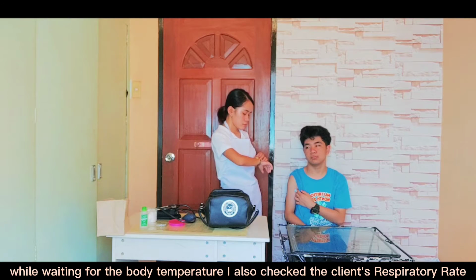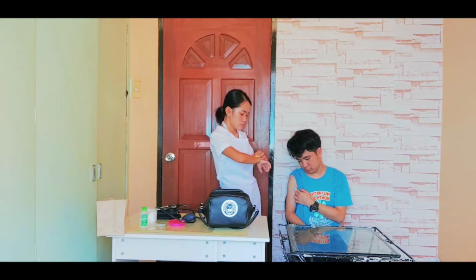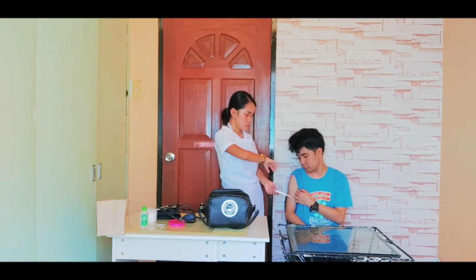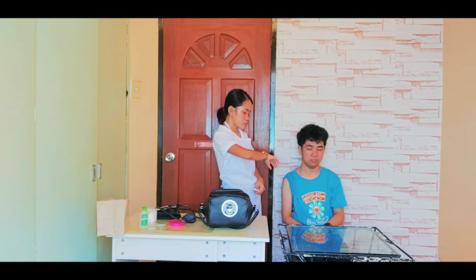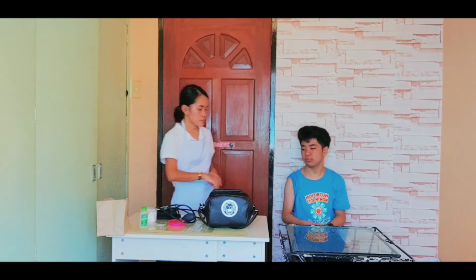While I was waiting for the client's temperature, I also checked the client's respiratory rate. Next, I'm going to take the patient's pulse rate.